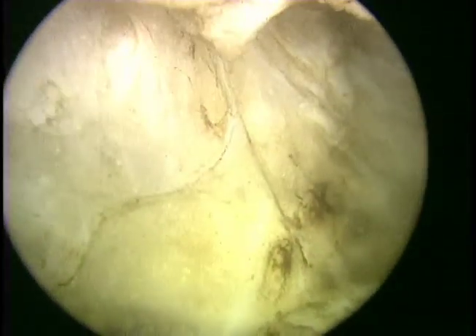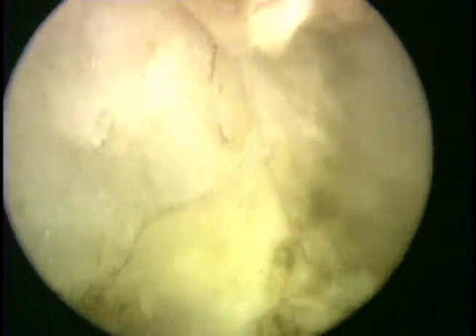We will continue inferiorly from our pre-established 7 o'clock groove and then anteriorly from the 1 and 11 o'clock areas of incision to come down to meet in the middle, at the same time not just removing the entire adenoma but also combining it with vaporization only with the 180 watt power setting.